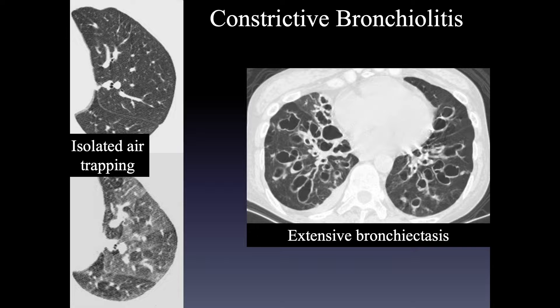The spectrum of constrictive bronchiolitis goes from isolated air trapping as the only abnormality — the mildest manifestation — to severe constrictive bronchiolitis present for many years that can eventually produce extensive large airways disease with cystic bronchiectasis and airways inflammation. These two cases show the full spectrum from most mild to most severe.